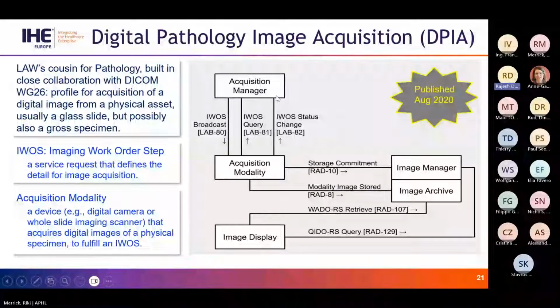The acquisition modality interacts with the image manager archive using established radiology transactions to store the images, and then established radiology transactions to display the image from the PACS system. Okay, and that has been published in trial implementation.